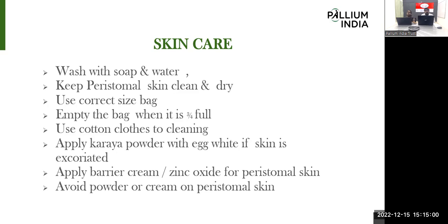Then use the correct size of bag. Already I told you we need to ensure the size of the stoma by using the measuring gauge on the basal faceplate.